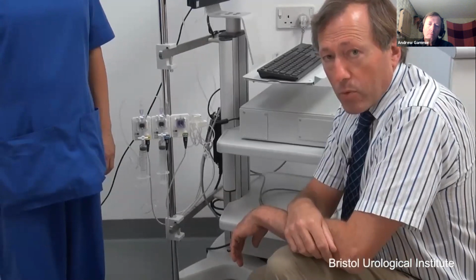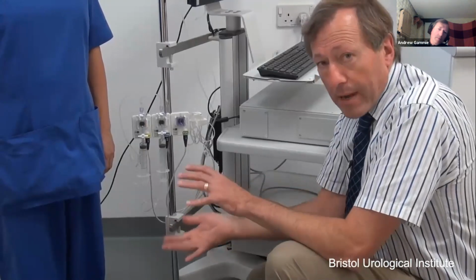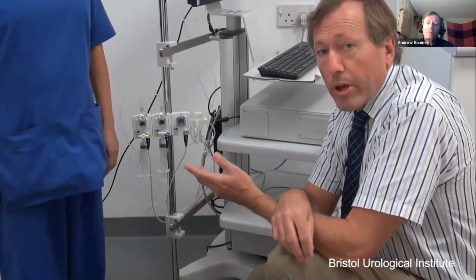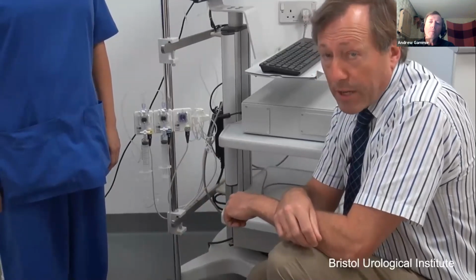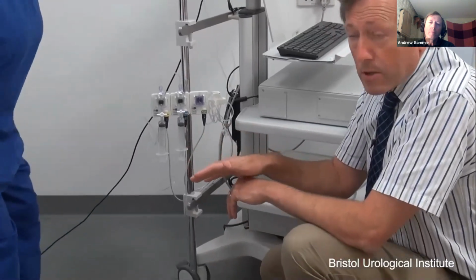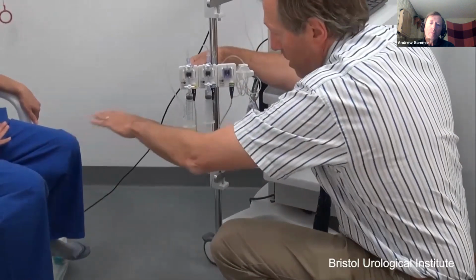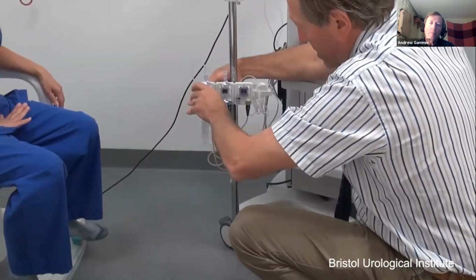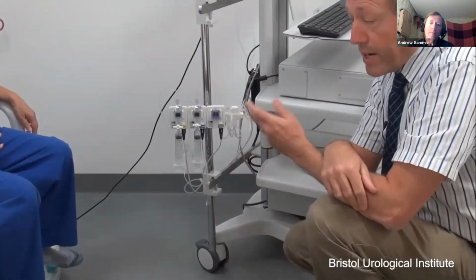For our male patients, we'll be filling and voiding, most likely in the standing position, with the flow meter mounted on a stand and a funnel in place. For the female patients, they'll probably only be standing for the stress testing to check for leakage. But we'll ask them, mostly for filling and of course for voiding, to be sat down on the commode. So when they do that, we're going to need to adjust the height of the transducers again to the level of the symphysis pubis, which is now down here. So I adjust the level until it is at the right place and tighten the transducer mount. Now we're ready for the voiding study.